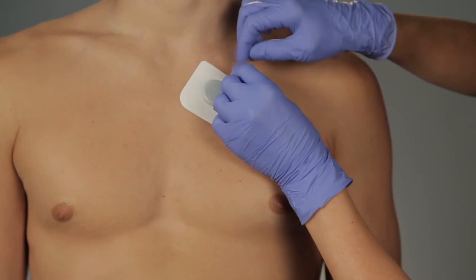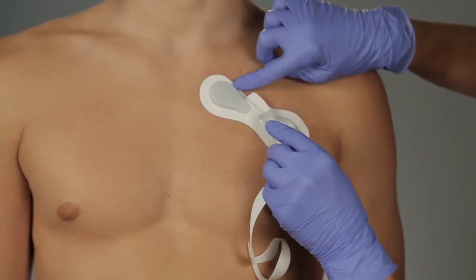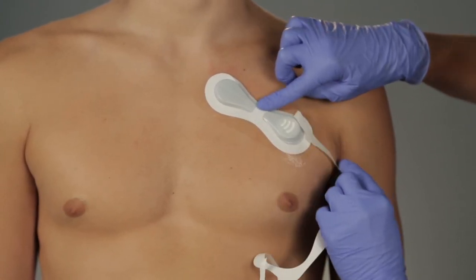Pull off the top liner starting at the angled corner. Gently press the Tegaderm to the skin as you continue to remove all pieces of the top liner. Press down firmly to seal all edges.